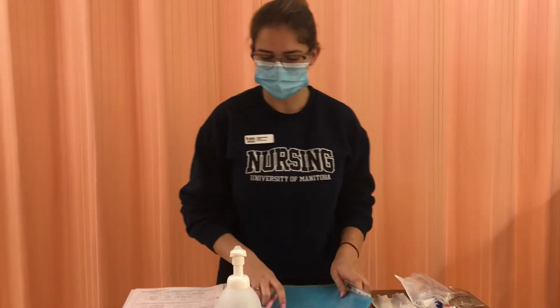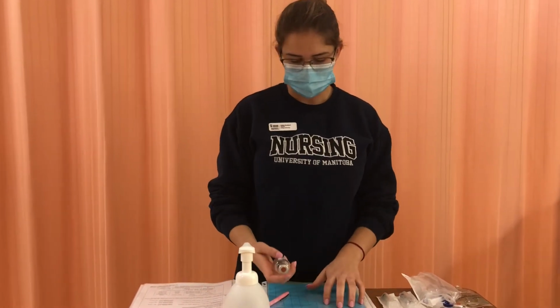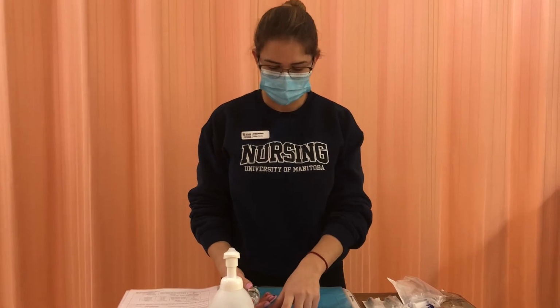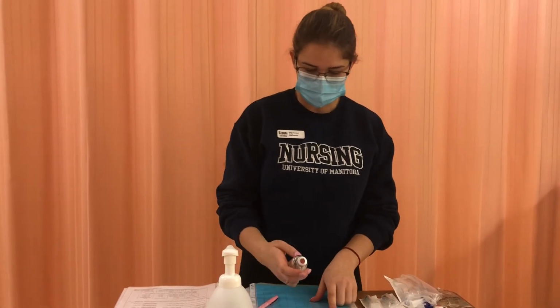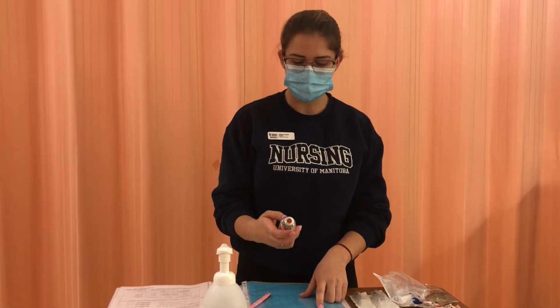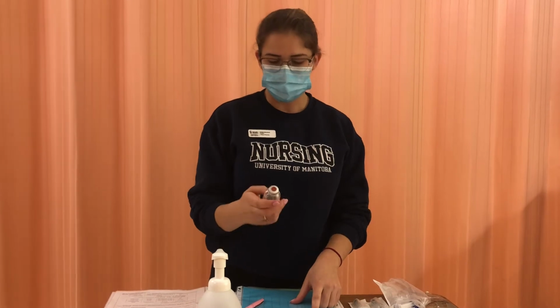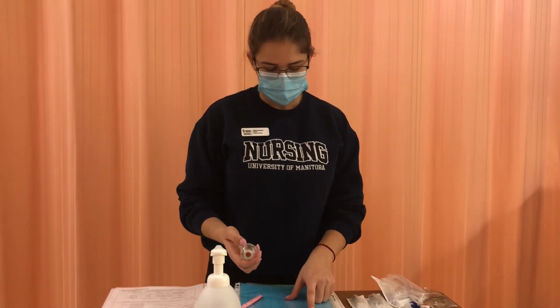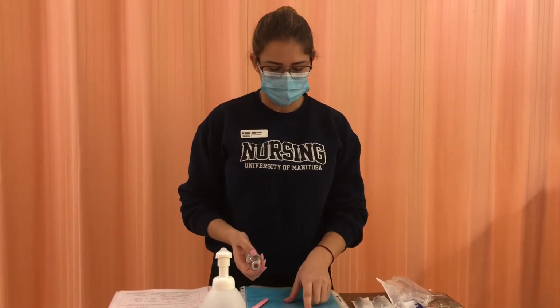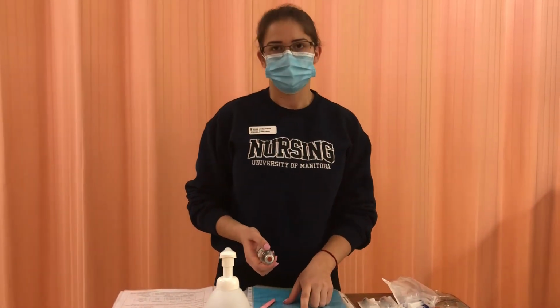Okay, so I'm just going to perform hand hygiene before I start touching my med supplies. I've already drawn up my cloxacillin from the Pyxis machine, so I'm going to do my first med check. I have Emma Wrightson. My drug is cloxacillin, this is cloxacillin. It's a 750 milligram dose, and I have 2,000 milligrams in the vial, so I'll have enough to draw my dose. It's an IV med. It says IV on the bottle, and it's to be given every 4 hours. I'd have 6 time slots marked here, and it's currently 1200 hours, and this drug has not been administered yet, so I'm going to give it now.